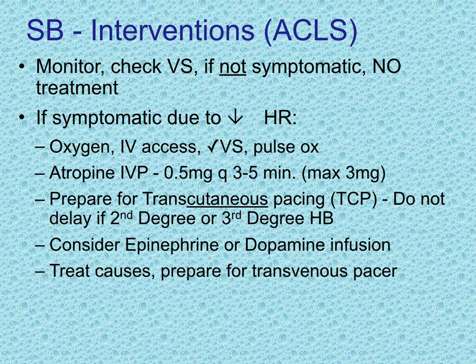I hope you find this presentation on sinus bradycardia helpful in your understanding of causes and management, and also how do we recognize our rhythms. And you want to start really implementing that triple R method, right? Rate, rhythm, and relationships all the way throughout the course, so you have a set mechanism to identify when things are outside of the normal rhythm.